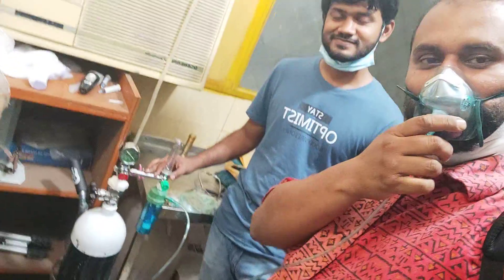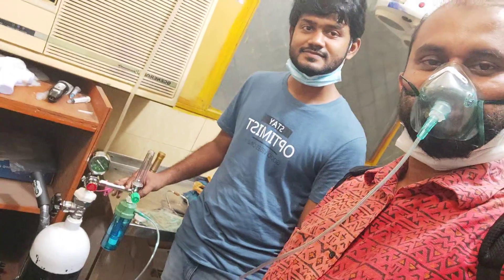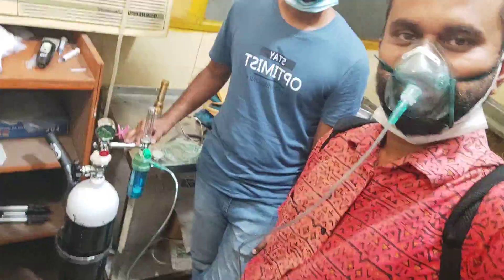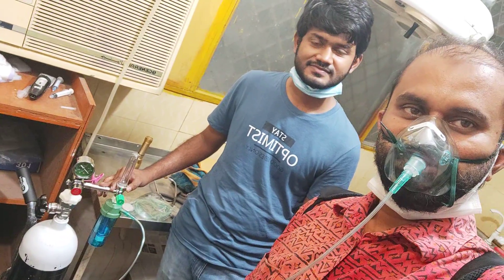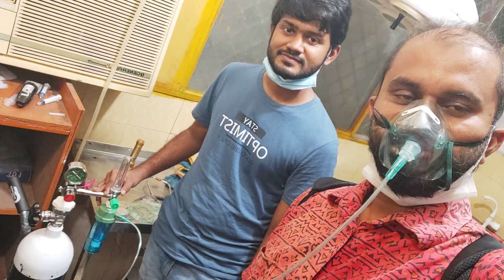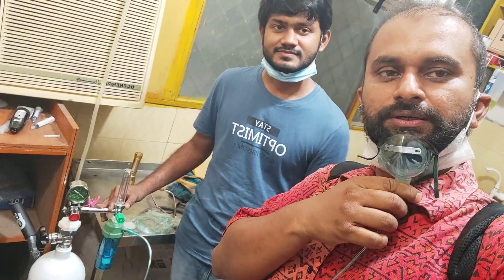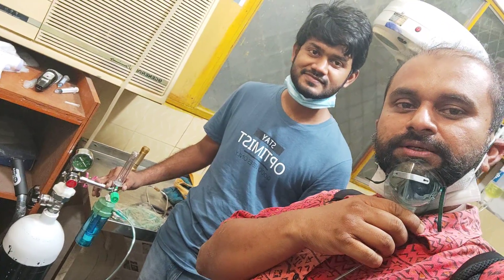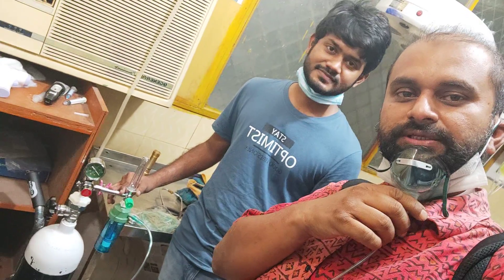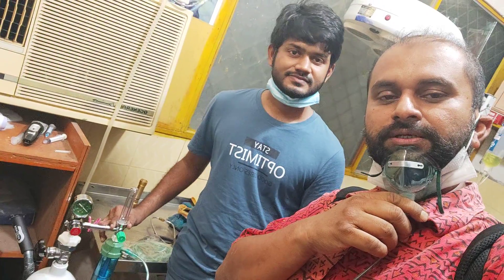Viewers, the doctor said that we would be using the emergency oxygen for the animal.